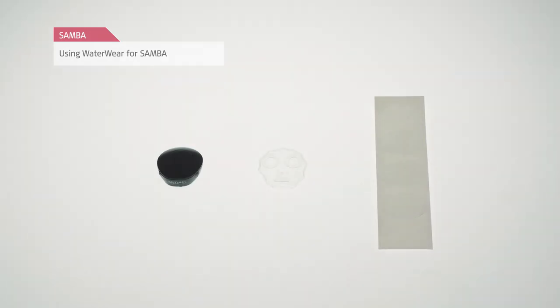Waterwear is a cover for the Samba Audio Processor that provides complete water protection. It consists of a skin and an adhesive seal tape. You can use each skin up to three times, but the adhesive seal tape needs to be replaced after each use.